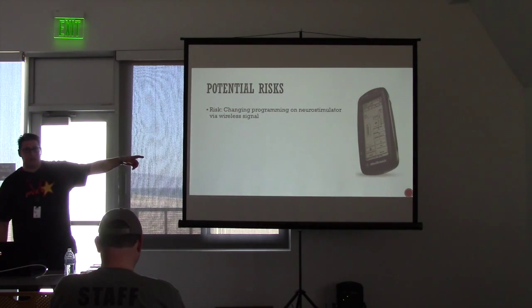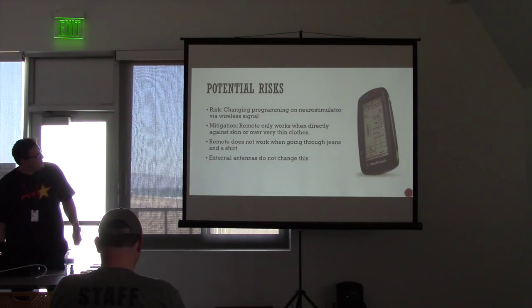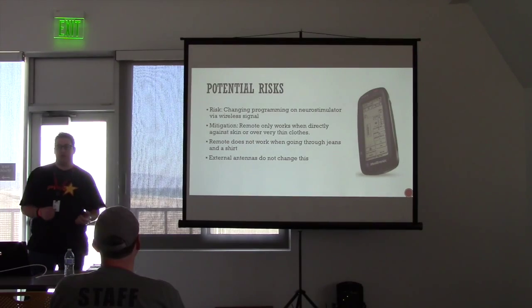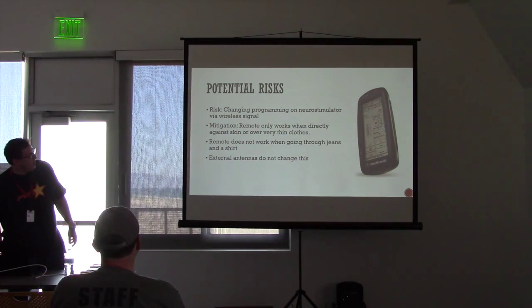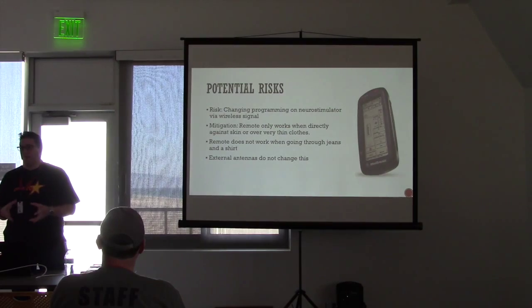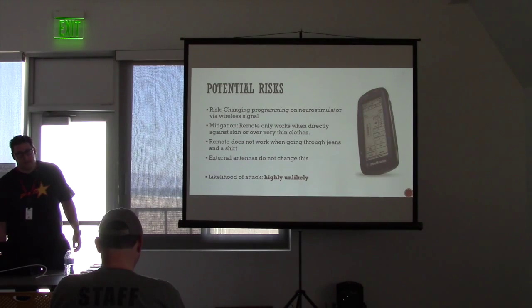So whether it's through the patient programmer, which is the only one that can program it, the remote can't. The remote literally just switches programs. So the mitigation: the remote only works when directly against the skin. We've been at places where my wife tries to put it over a coat or a sweater and has to move multiple layers around to get it to work. So it literally has no range. And external antennas do not change. The clinician programmer uses the same antennas. It has to be close to the device to even receive a signal. There's a magnetic charge, there's a magnetic activation. Likelihood of attack, highly unlikely.